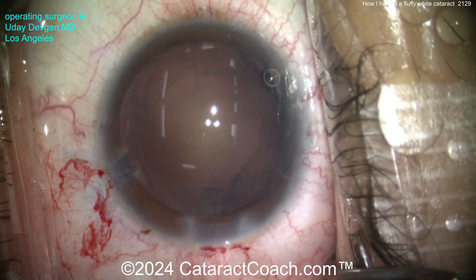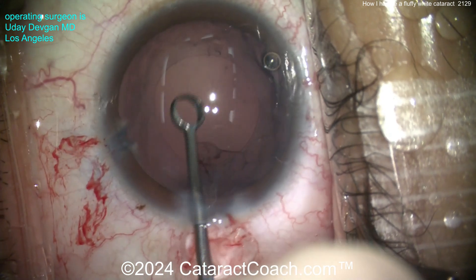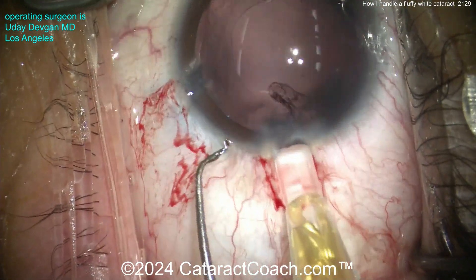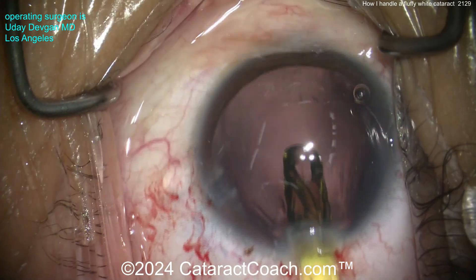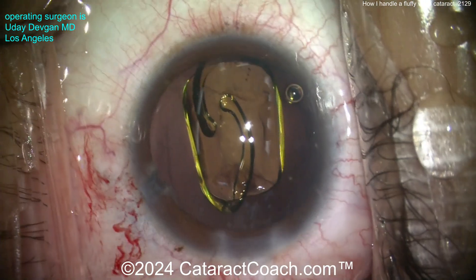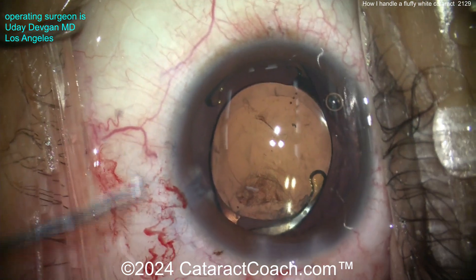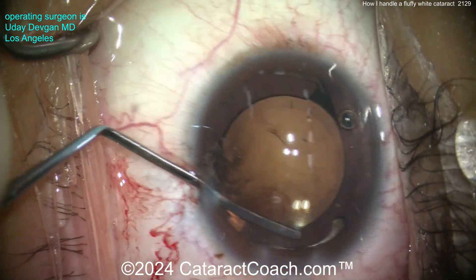Viscoat going inside — love that rhexis; it looks pretty darn good. Going inside to do some polishing, because I'm thinking long-term — I want a beautiful result for this patient that lasts 50 years. Here comes our lens: it's a single-piece acrylic toric design, so we're correcting the astigmatism as well. Getting it through a tight incision — I want it nice and small. The lens is opening up; you can see the toric marks at the haptic-optic junction. Getting that lens rotated into the appropriate position.